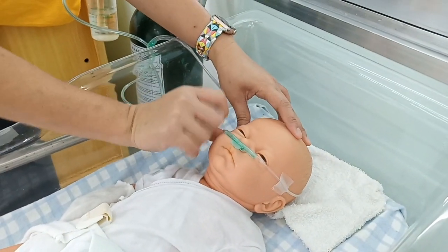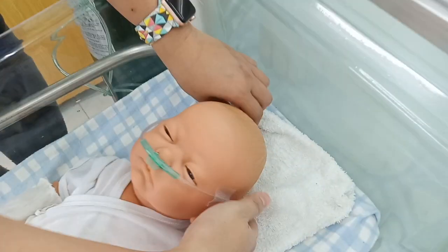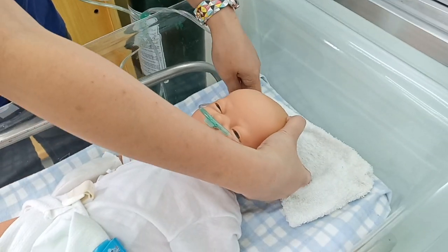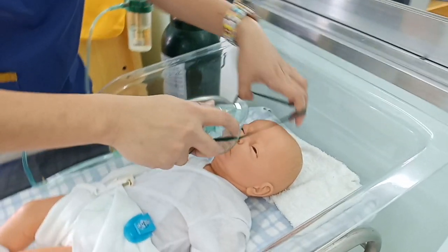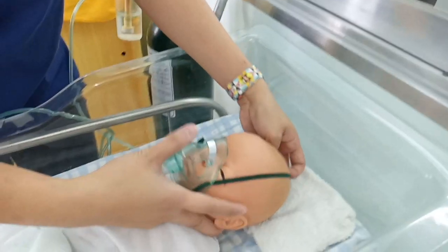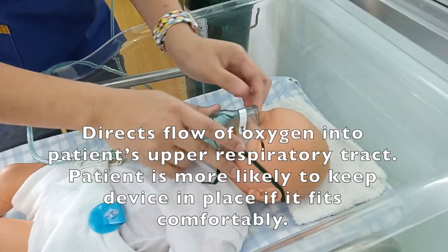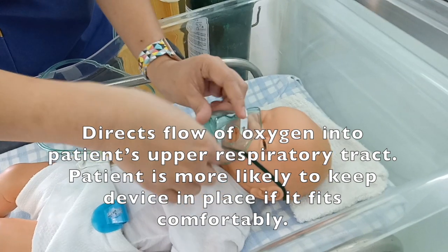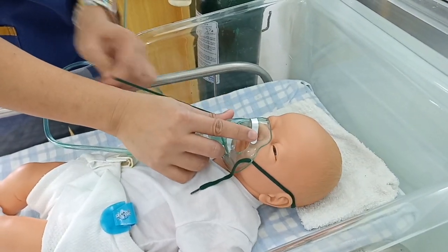Follow procedure for the equipment you are using. Position tips of cannula properly in nares and adjust elastic band or plastic slide on cannula or face mask so that a snug, comfortable fit is achieved. This directs flow of oxygen into patient's upper respiratory tract, and patient is more likely to keep device in place if it fits comfortably.